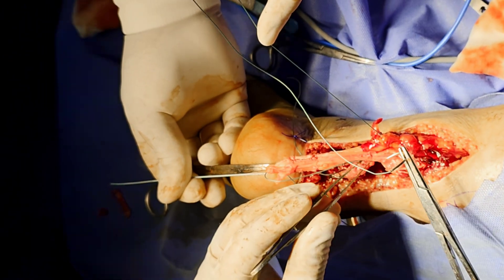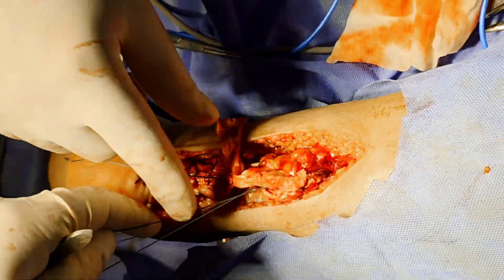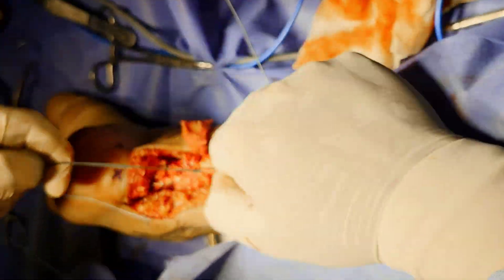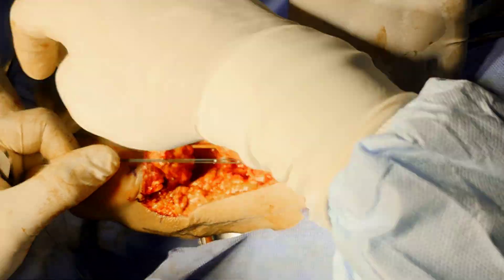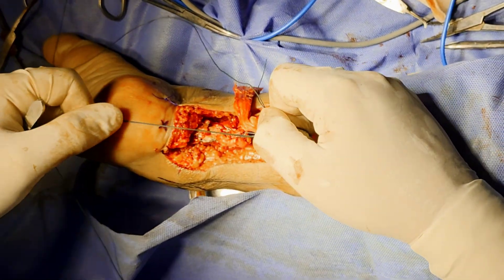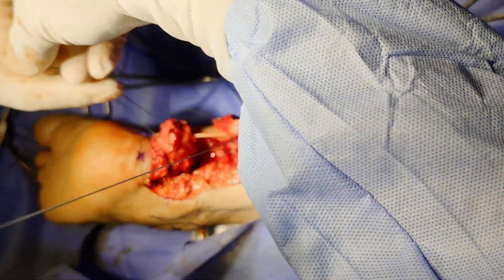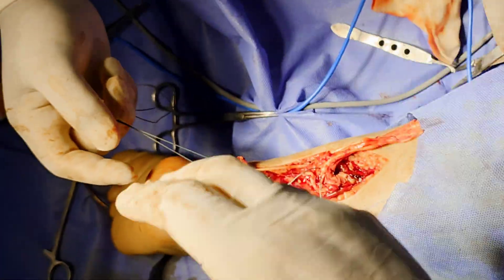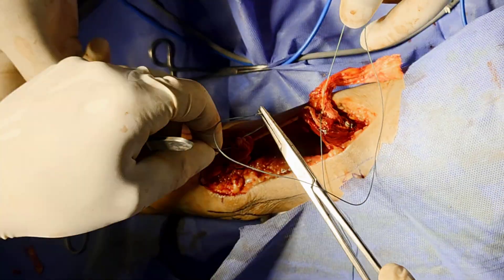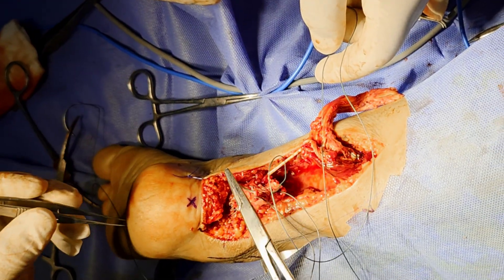There is a remnant part of tendon overhanging the rupture site — we have not cut it, because it is the principle of plastic surgery to save viable tissue. We will use this hanging part of tissue to wrap around the anastomosis. We confirm the strength of our Krakow sutures — the strength feels good — and the proximal and distal stumps are easily approximated once tightened. We are now converting this into the modified gift box technique.